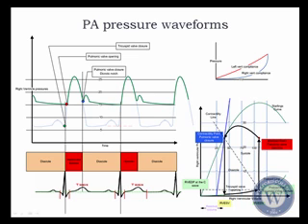The green point here would be equivalent to the tricuspid valve closure, which is here, which is really your preload point. So this line that's being generated, this pressure wave, indicates how effective the contractile force is. One of the things we'll talk about later on is that this angle of attack can tell you a certain degree of the effective contractility taking place in the heart.